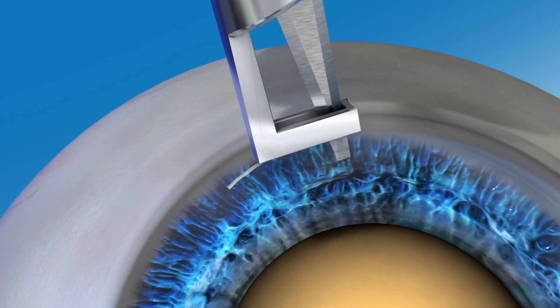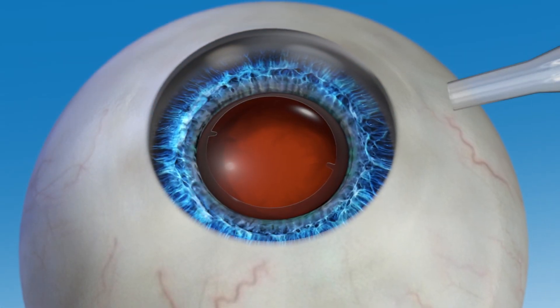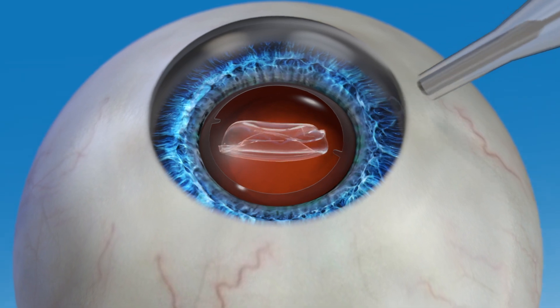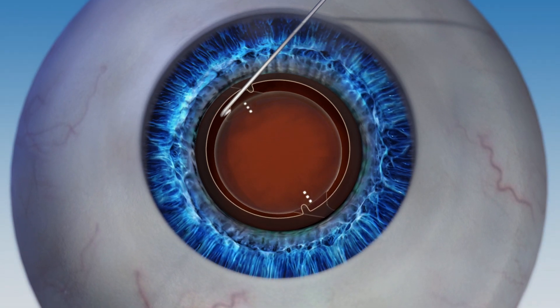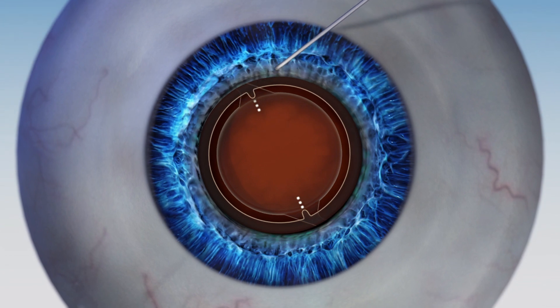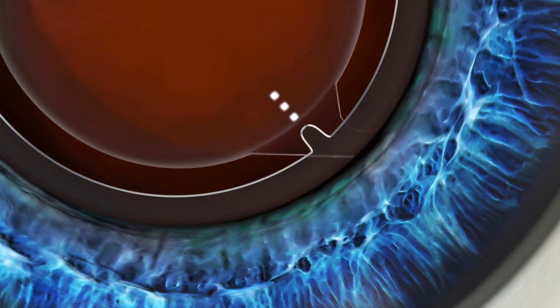These incisions can be made more precisely with a laser compared to manually making them with a blade. If you have a greater amount of astigmatism, your surgeon may recommend a special toric IOL to correct it. The Lenzar system helps your surgeon to precisely align the toric IOL where it needs to be, because a toric IOL must be accurately aligned in the eye in order to provide the best visual outcome.